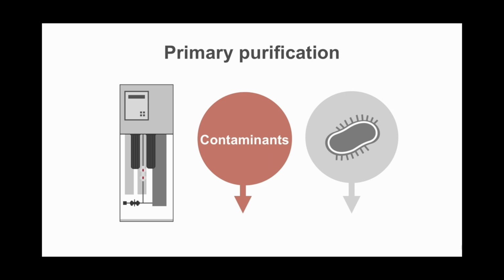Then we go into the RO membrane. Now RO is a semi-permeable membrane. What happens here is that the pre-treated water goes through this membrane at high pressure. This high pressure causes the filtration. So there is a high pressure filtration through a semi-permeable membrane. Now this membrane holds back the solute, whatever remaining is present.